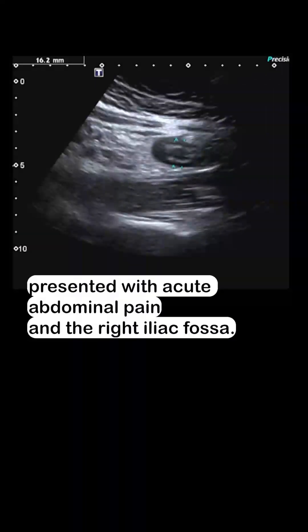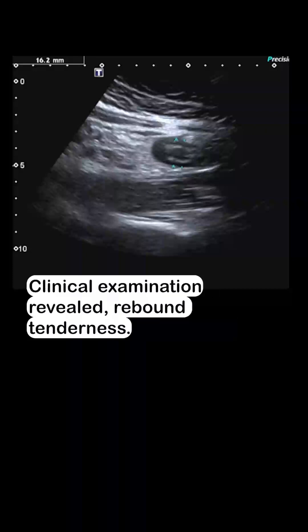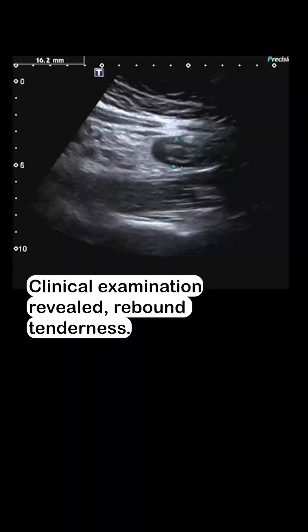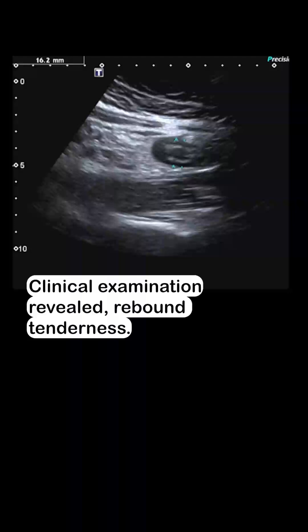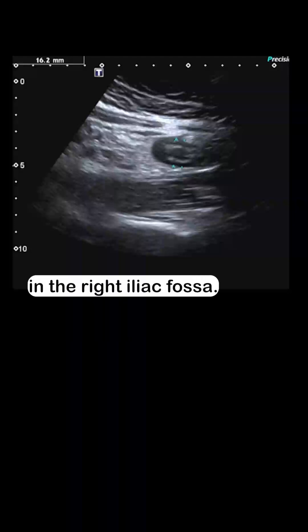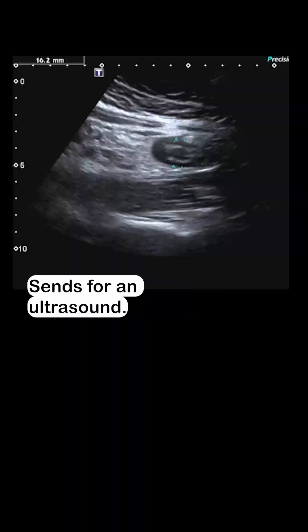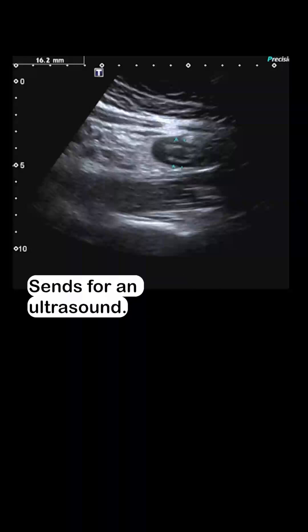A 24-year-old lady presented with acute abdominal pain in the right iliac fossa. Clinical examination revealed rebound tenderness in the right iliac fossa. The clinician suspects acute appendicitis and sends for an ultrasound.